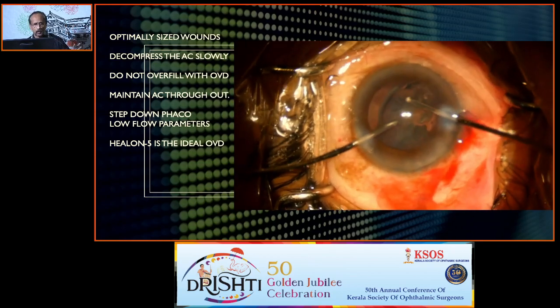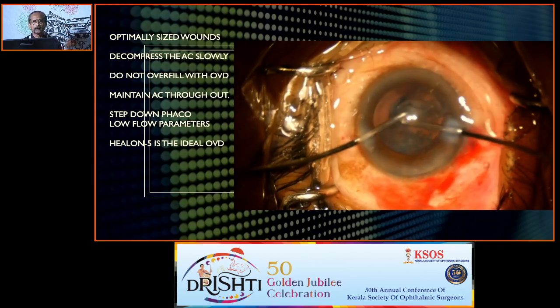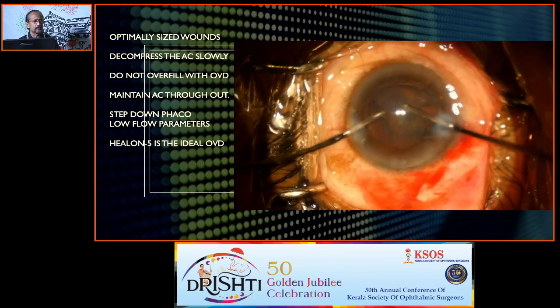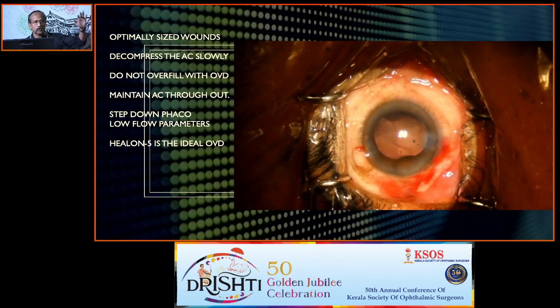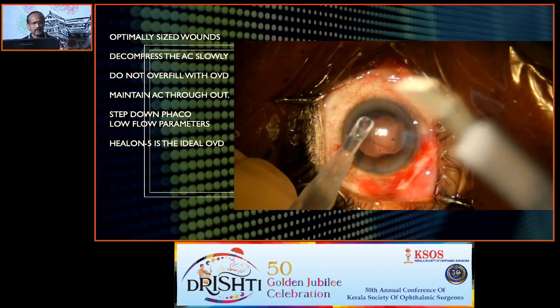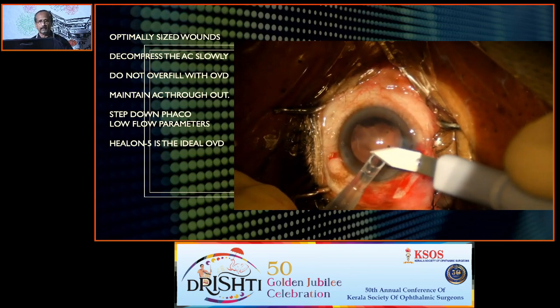Ocucoat is dispersive OVD. Underneath that, I use the regular hyaluronate. And for phacoemulsification, I use a combination of chondroitin sulfate above and HPMC below. And in these eyes where the lens power is very high.